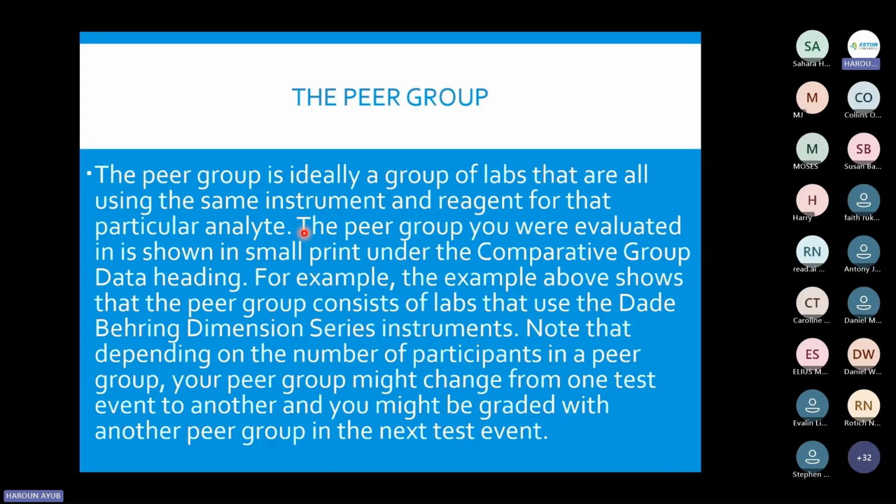You find that in your instrument peer group, some people do not submit the basophil differentials, they omit them. If the analyzers have issues in reading those particular differentials, they'll omit. And when you put it there, you're not getting the other groupings. But in the next survey, they put their results there. So that will depend on how that particular question is handled.